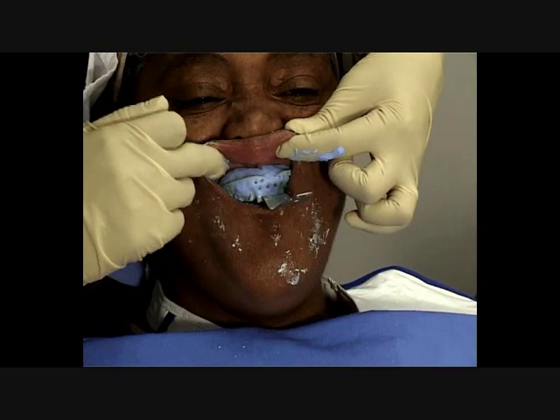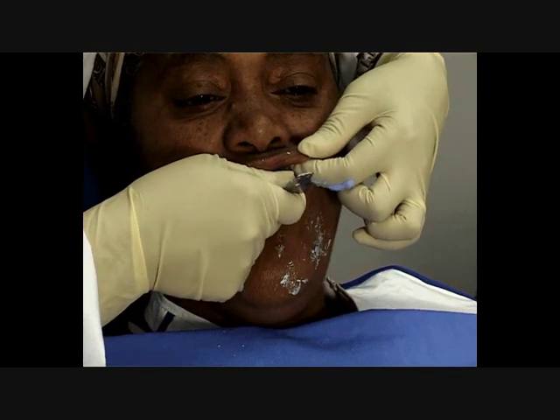Step 4. Remove the impression when the alginate has set fully.